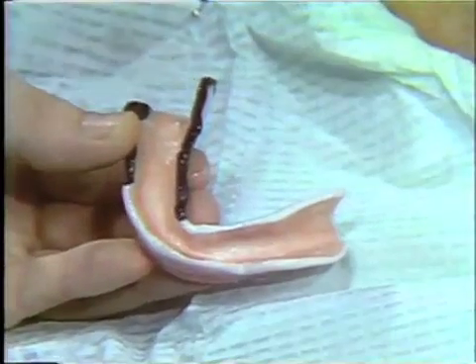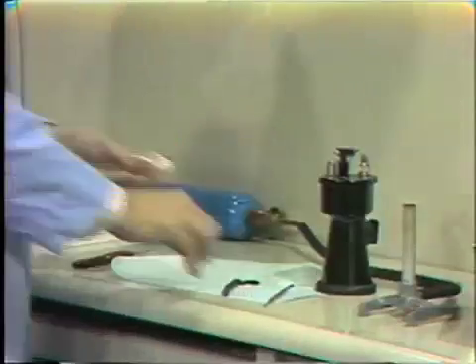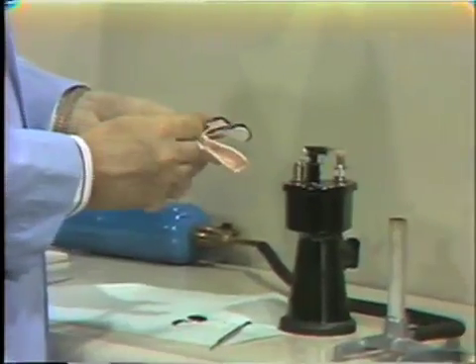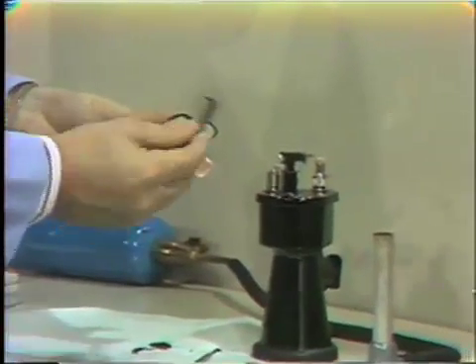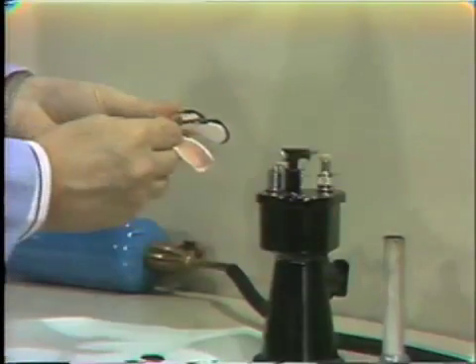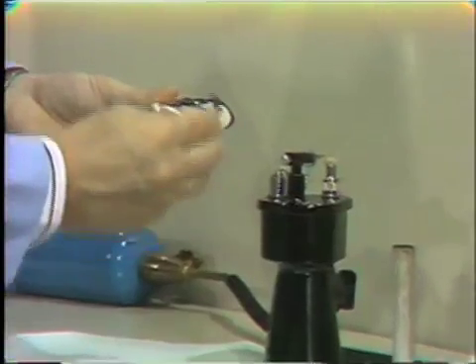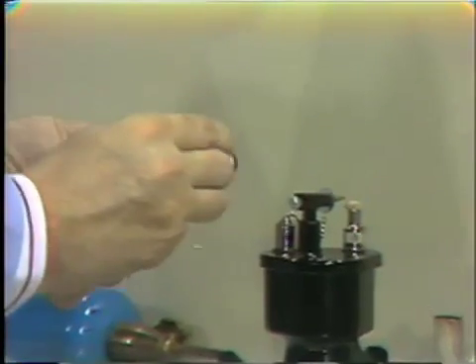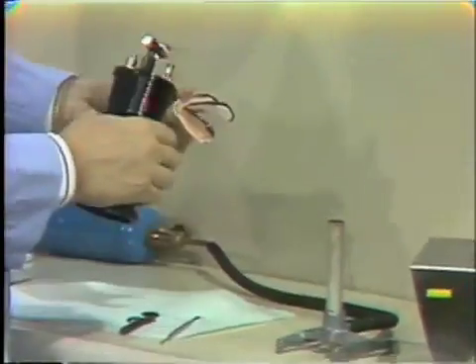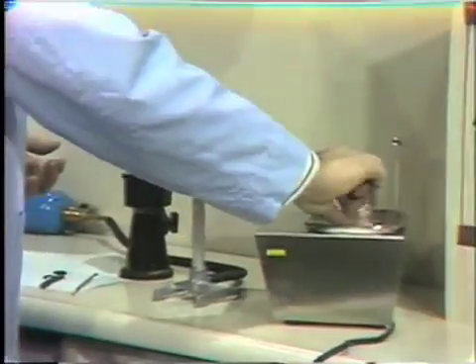Being satisfied with this, we can return to the compound and border mold the other half of the tray — again adding just small short segments with the compound throughout the length of this lingual flange. We'll return to the patient after tempering to perfect that lingual flange.